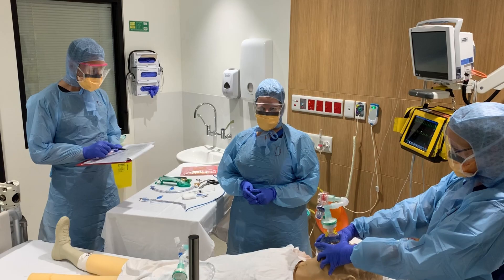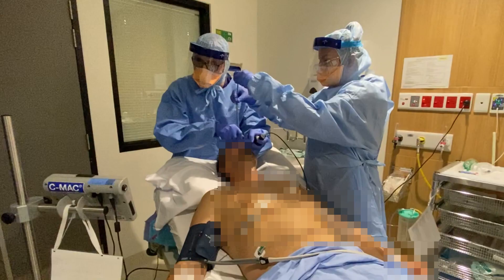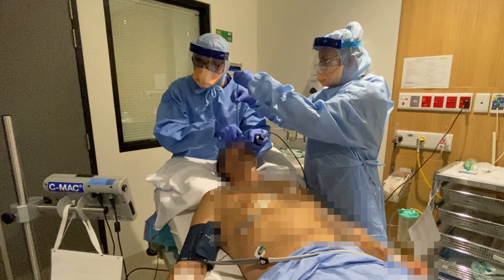Here is the emergency physician team leader using the command sequence to ensure that the steps for preparation are proceeding according to the agreed script. Here's the airway team being 100% focused on a swift video laryngoscopy and intubation before the patient desaturates. Unlike in normal anaesthesia, they can't be concerned with the rest of the patient's physiology right now — just the anatomy.